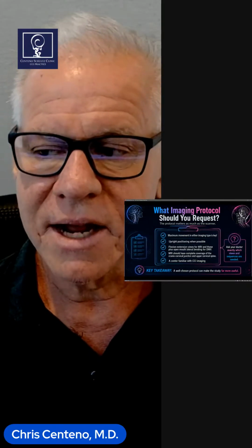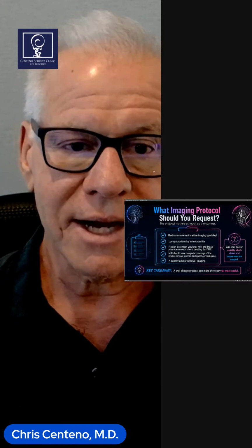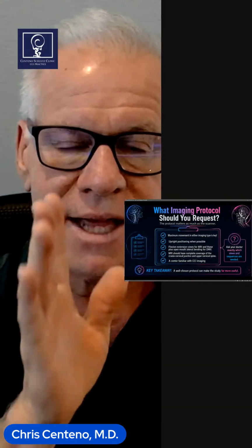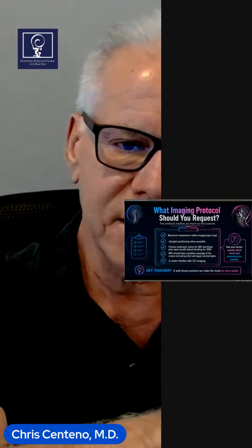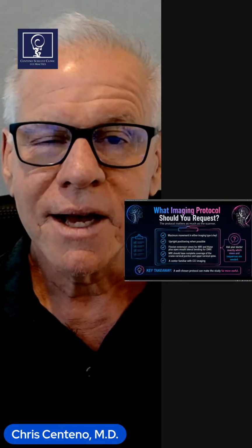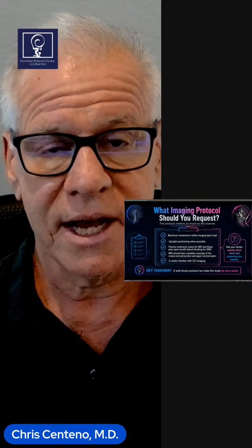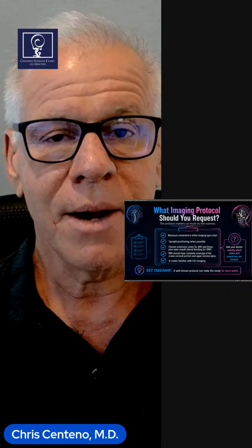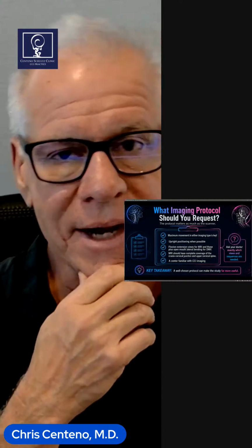And then make sure that you've got the right views is the third rule. For upright MRI and DMX, that's flexion and extension. And then DMX adds that additional piece of open mouth, lateral bending, left and right, where we're looking at C1, C2. Doing that with a DMX makes sense, or even doing that with an X-ray makes sense. Doing that with an upright MRI, sometimes I'll see some of the German MRIs that have sort of lateral bending views.